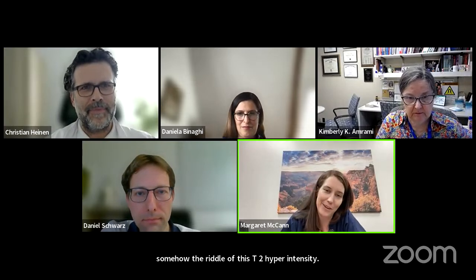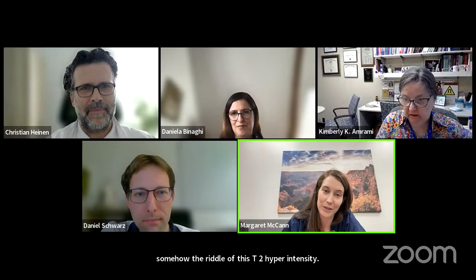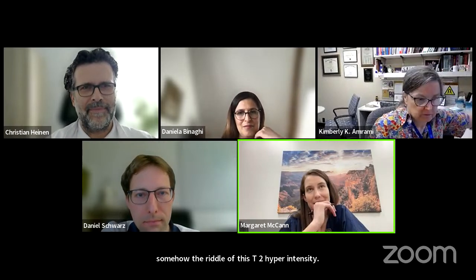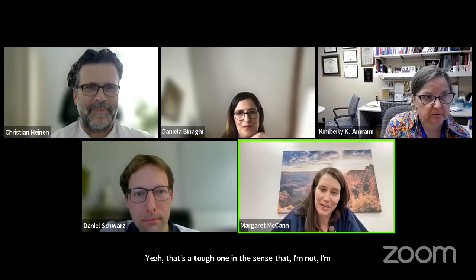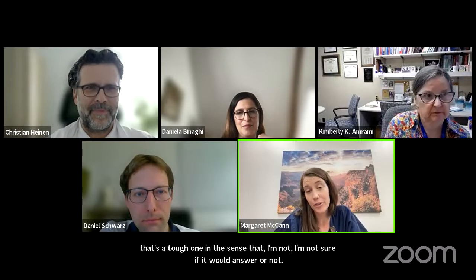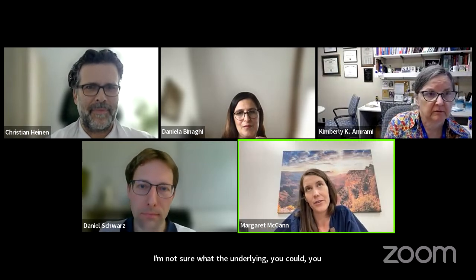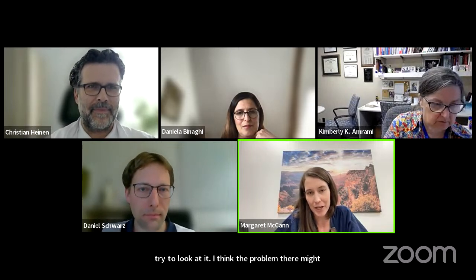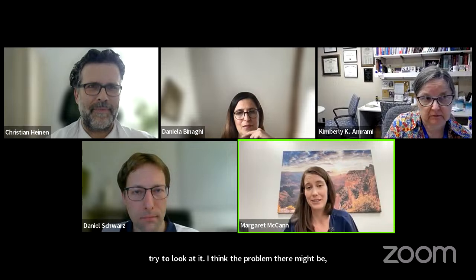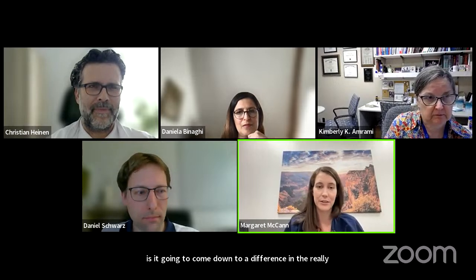You could definitely look at that. That's a tough one, in the sense that I'm not sure it would answer the question. What we're really measuring is density and coherence of the fibers.